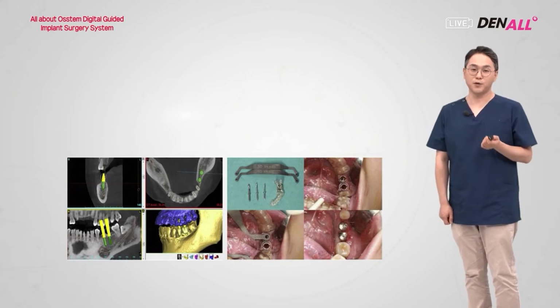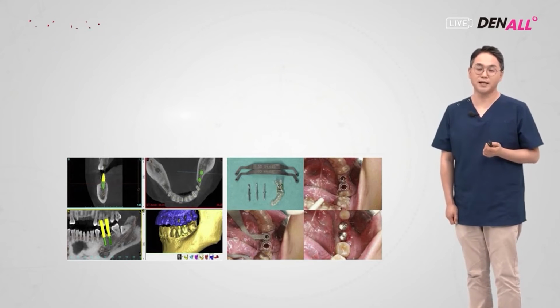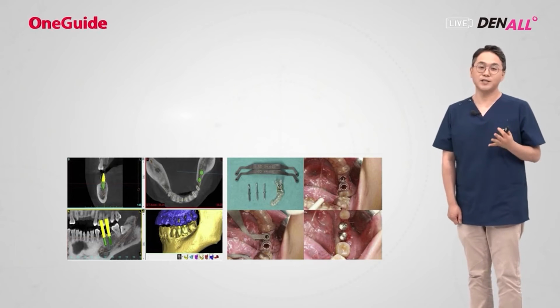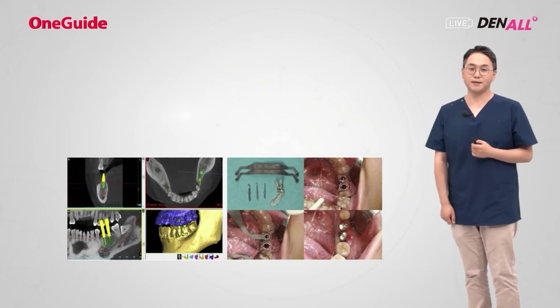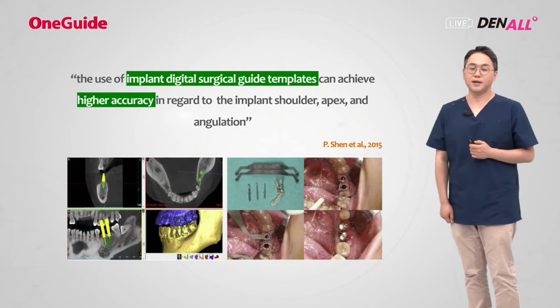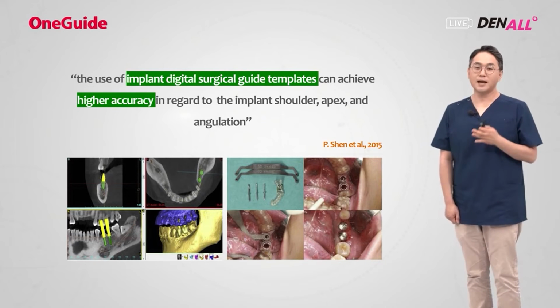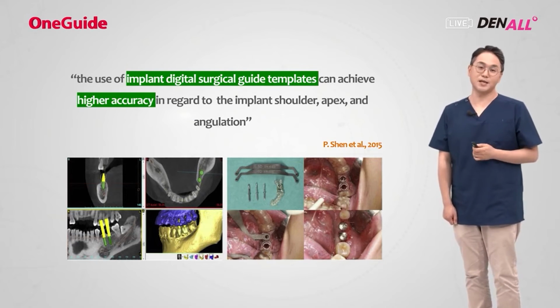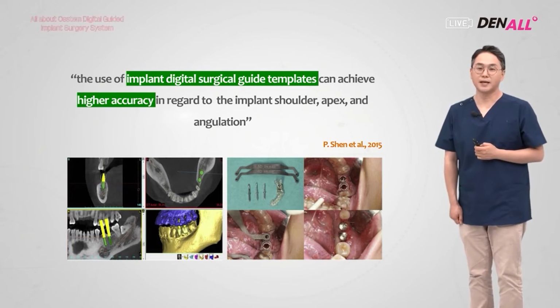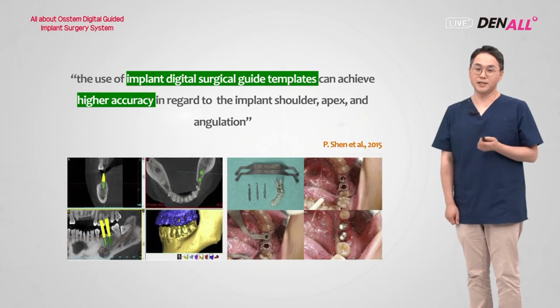Using the implant program, planning was done. In one group, free-hand surgery was done, in other words, based on the surgeon's experience. In another group, a digital template was used for implant placement. Regardless of how experienced you are, the digital guide surgical template showed higher accuracy. Regardless of your expertise, the digital guided surgery was very useful.